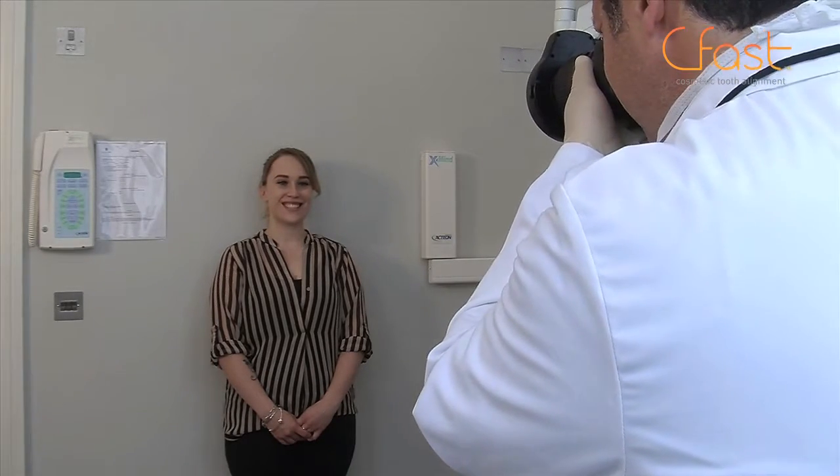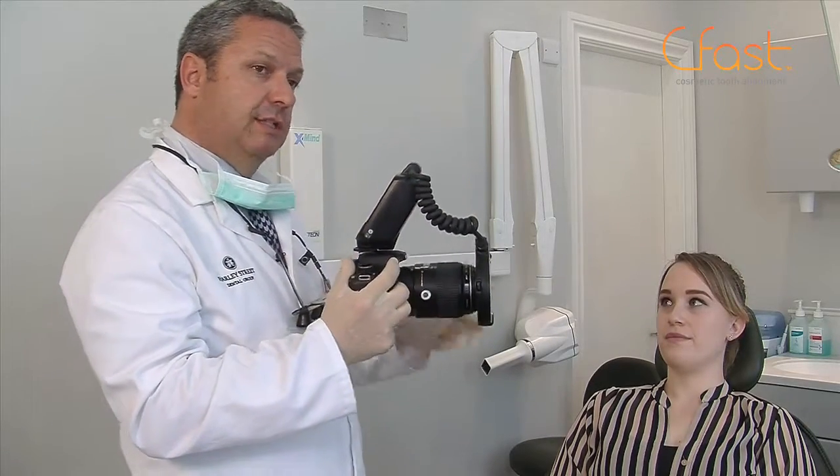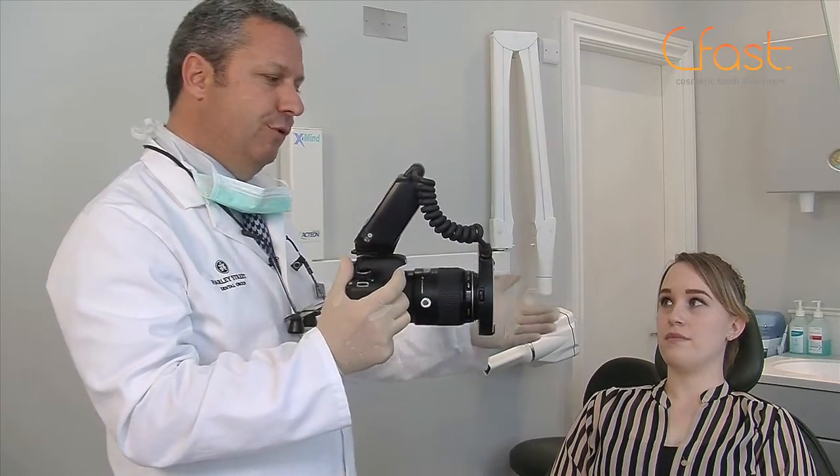A big smile, Heather, that's great. And there we have our full face shot. So Heather, we've taken her full face. We don't have a card here, so we've taken that against the background, and we've now moved to the chair.